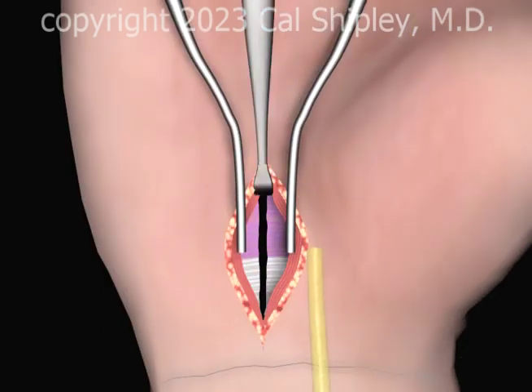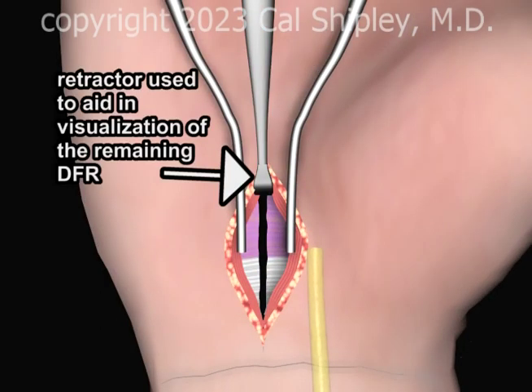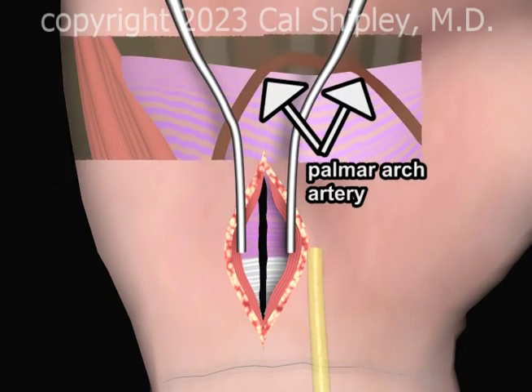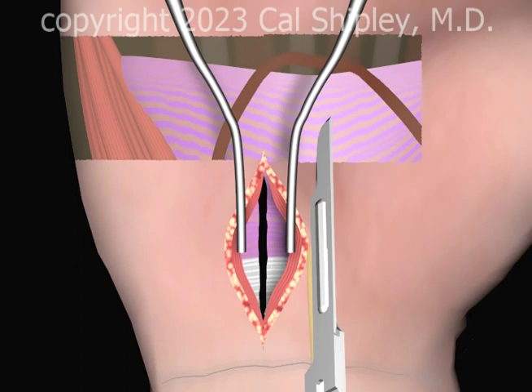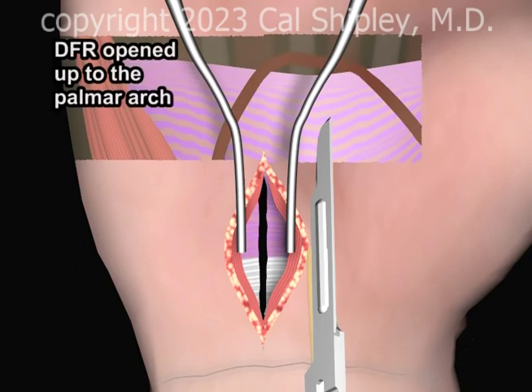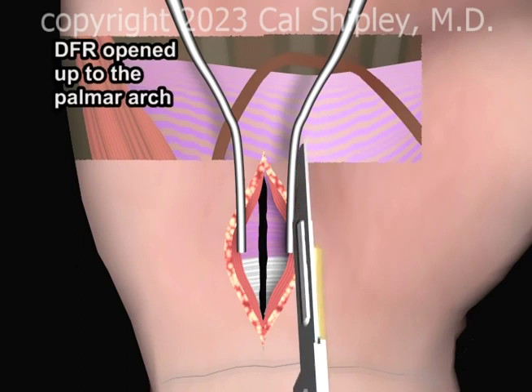A retractor is used to visualize the remaining portion of the DFR. The DFR extends distally to the superficial palmar arch artery. A scalpel is used to open the DFR up to the palmar arch.